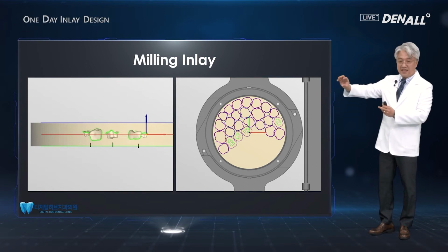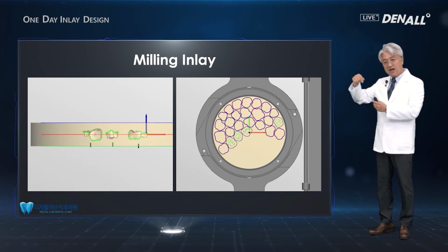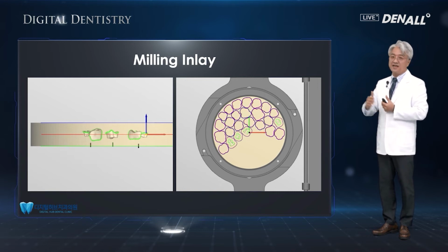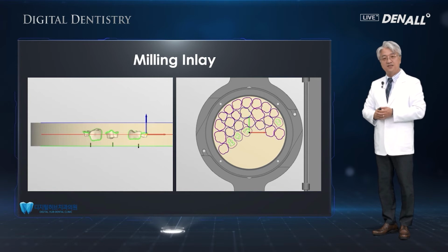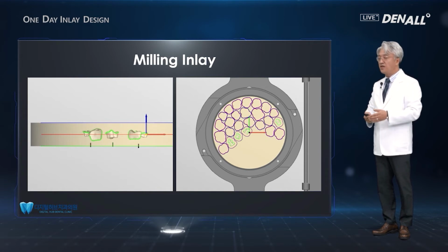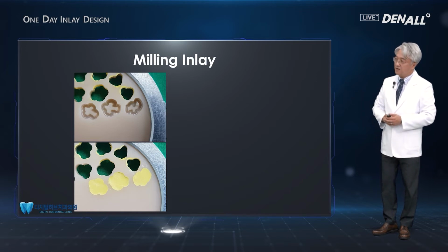So in the disc, where to position the inlays, and using milling machine when you do the cutting or milling, which burr needs to be used, and all this needs to be calculated beforehand. And software used for that calculation is CAM software. And using the CAM software, the inlay positions are determined, and then the calculated tool path or the values are given to the milling machine. Then you go to the next step of the inlay production.